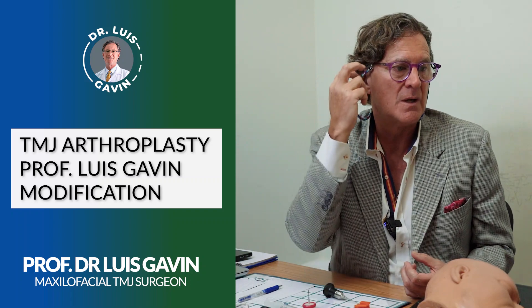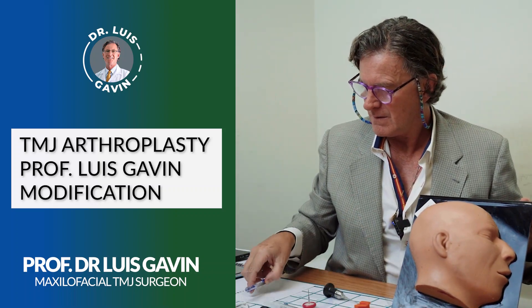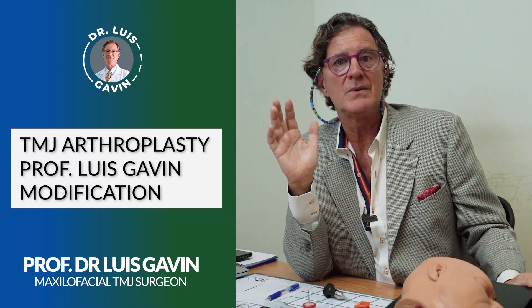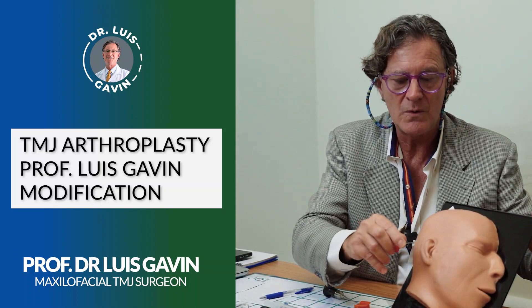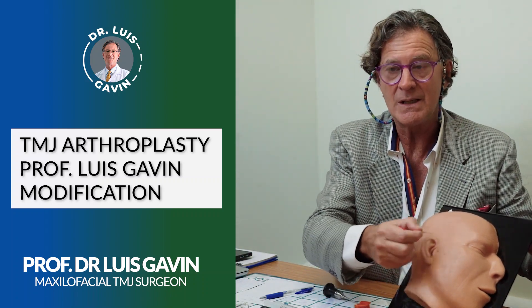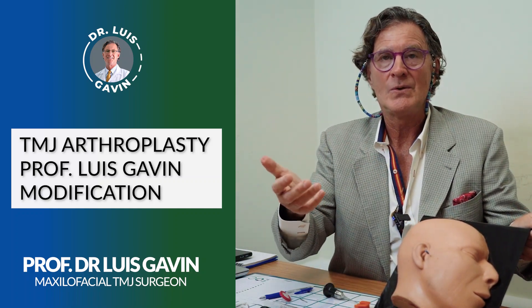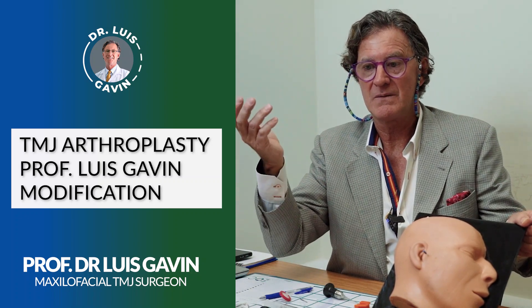Arthroplasty before was a procedure where we had to open, cut along the design here on this model, then go inside to have vision. Nowadays that is not the case. Only what we do is go with small pins inside, in and out, with different instruments and different sizes — only like needles, with no scar, no stitching, and no aggressivity. For that reason it is described as a minimally invasive procedure.